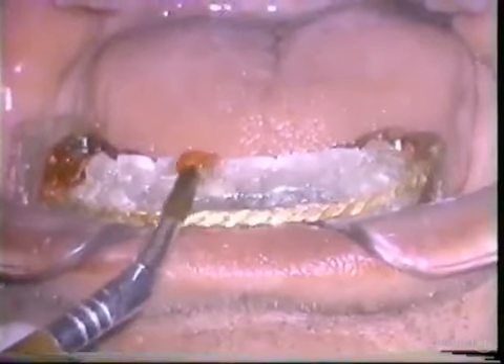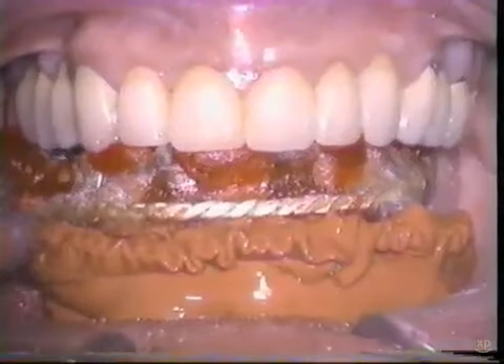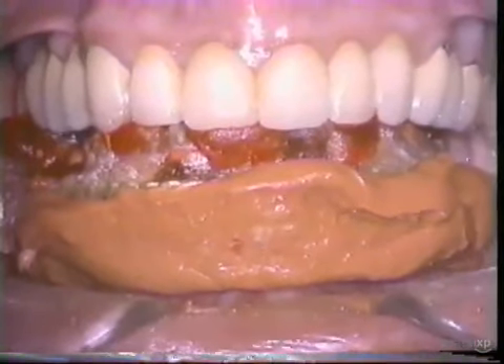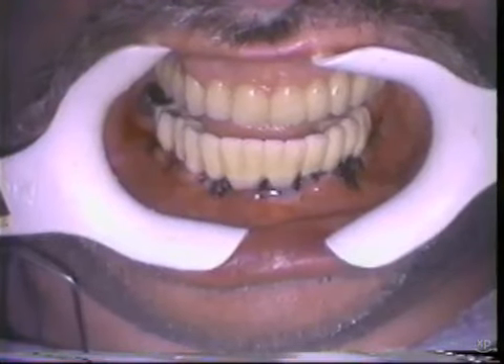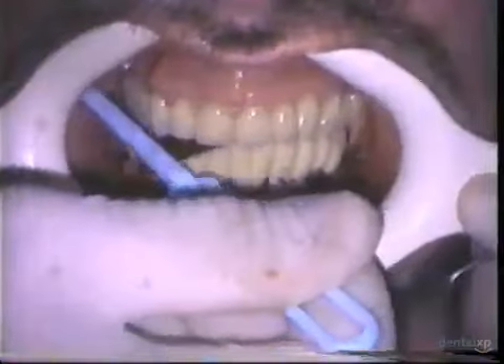In the same way, we use the surgical stent to lute the transfer implant copings to the surgical stent and take a bite registration on the retruded arc of closure, again at the verified vertical dimension of occlusion. In the same technique, we lute them on the buccal and the lingual. And then we take an elastomeric impression to record the soft tissue position for the laboratory technician. So now when this patient bites down, you have the bite registration at the therapeutic occlusal vertical dimension. We can fabricate not only our immediate provisional restoration, but also we have a final impression to give to the laboratory.